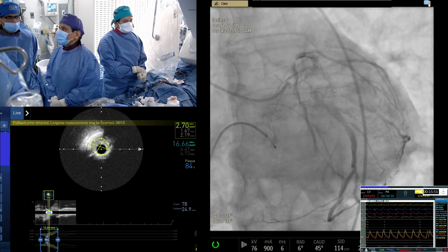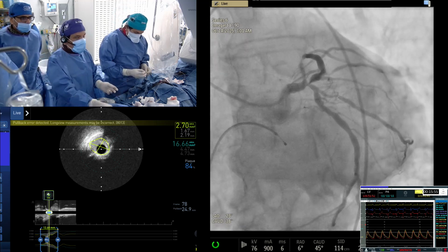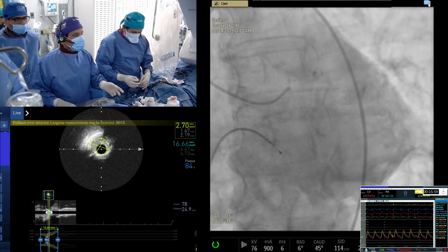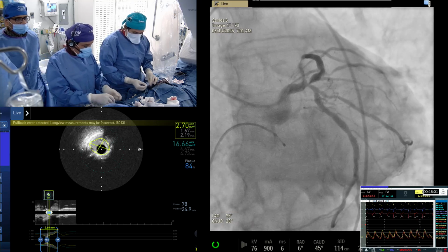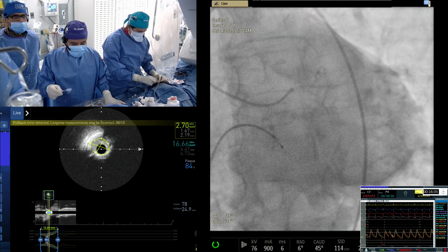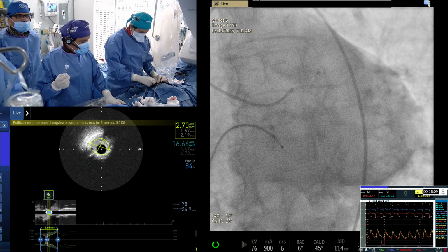If you're asking the question, yes, go. I would say that the IVUS just confirmed it because it is very significant. Now, the only question was whether you need a more aggressive approach in terms of IVL. But no, because there's not much calcium, it does not need rotablation. I think it will be good enough to do it now.